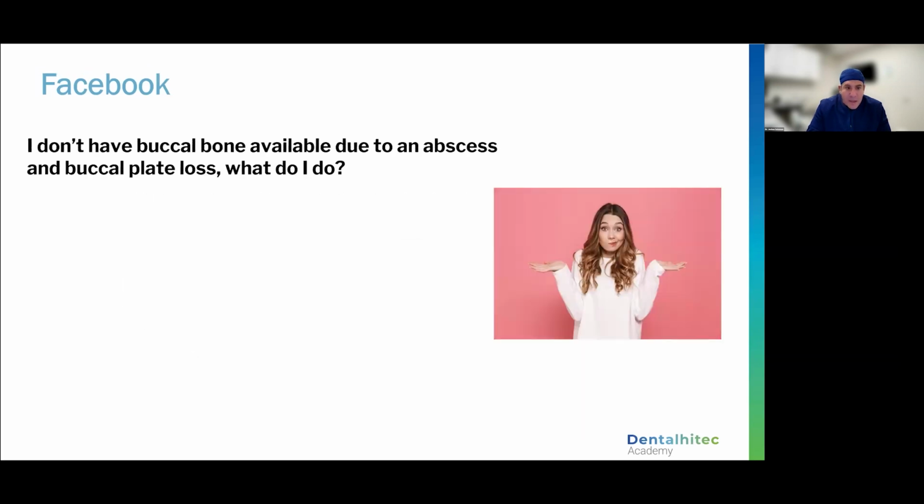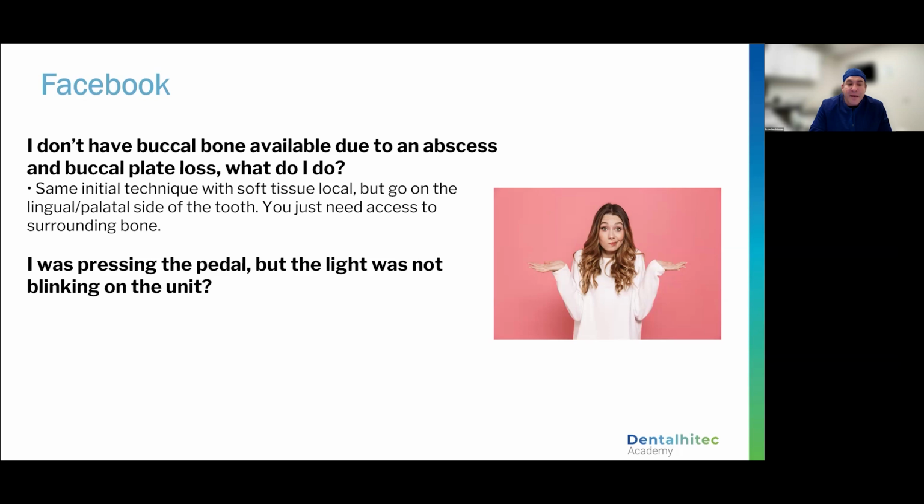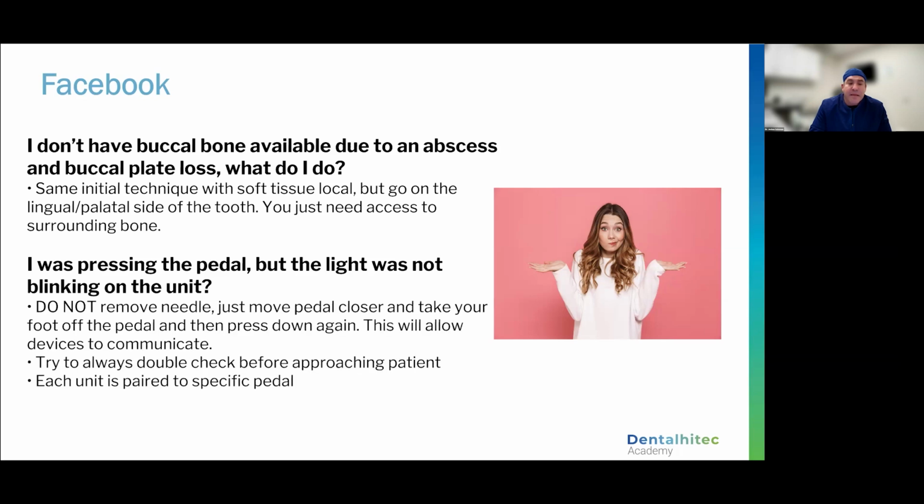Okay. We talked about how you may need 2 different sites if you have an abscess, or give it palatally. Absolutely fine. And if I was pressing the pedal but the light was not blinking on the unit, it may not be on. So please remember that mantra ahead of time.